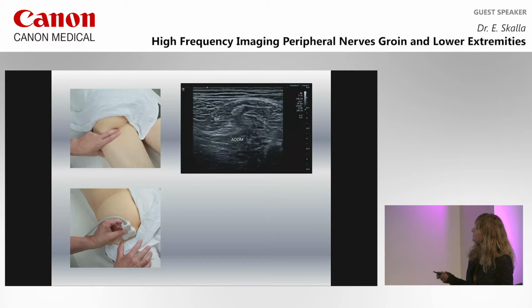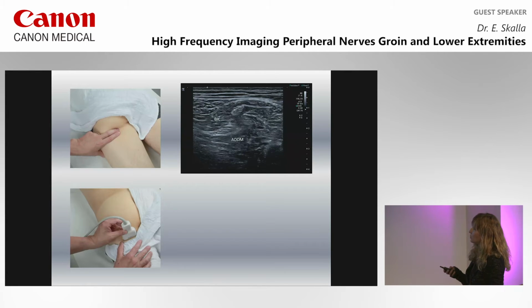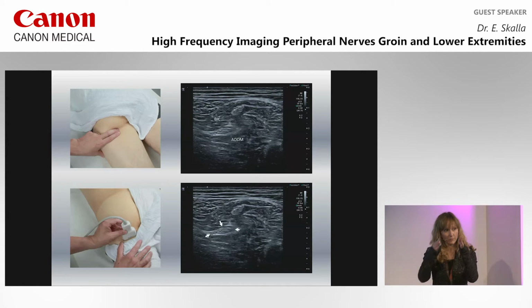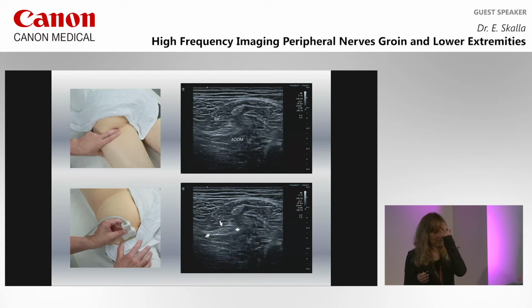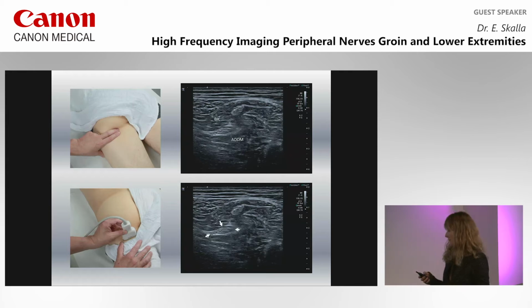You get this picture. The hamstrings, you probably know. So internal landmarks, the most important one is the long head of the biceps femoris muscle, and in the deep, the adductor magnus. And in between those muscles, we see once again this huge nerve. It's easy to find, and you can follow it the whole thigh downwards to the popliteal fossa, to the bifurcation in its two branches. As a variation, we could see the whole length of the thigh two nerves lying beneath each other when there's a high bifurcation of this sciatic nerve.